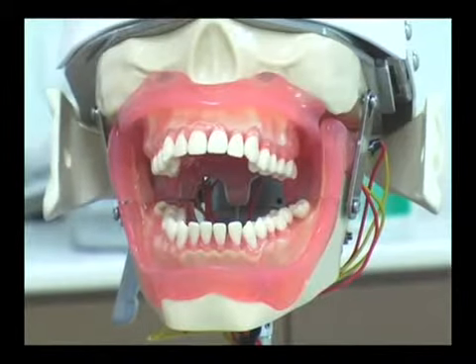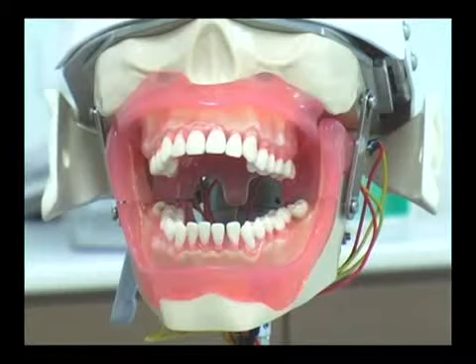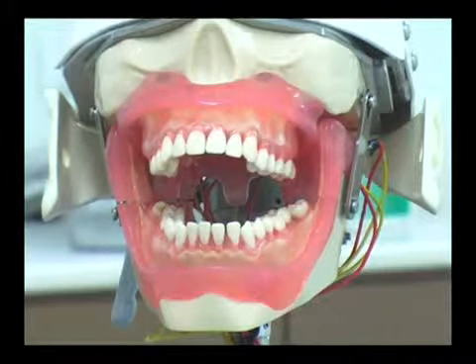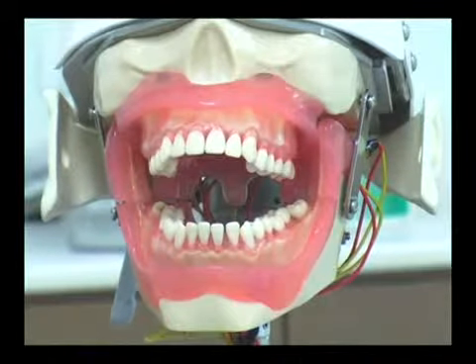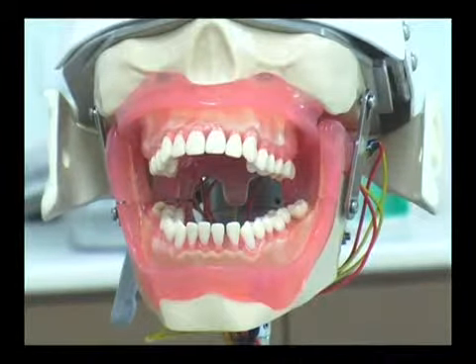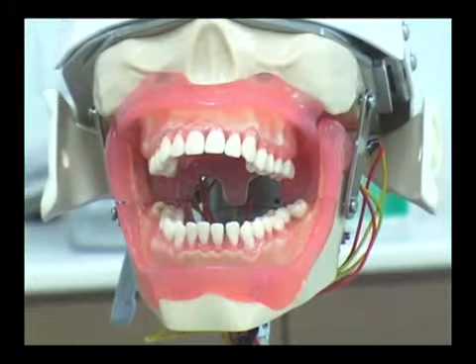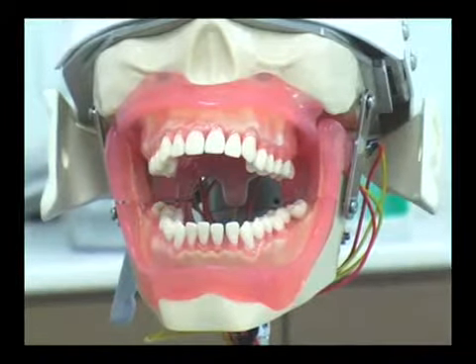Video demonstration for administration of inferior alveolar nerve block on a mannequin. It is very important for the success of the local anesthesia that you should be aware of the anatomy. So we are going to switch on to the other model quickly to see what are the important landmarks which we should recognize and identify while administering local anesthesia.